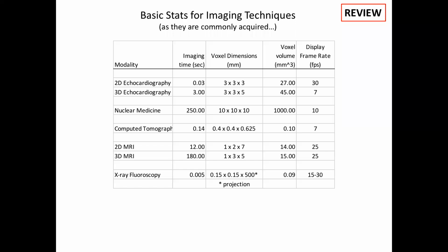Okay, so I have one single plane inside the patient, and I'm making images of that plane 30 times a second. And so it's right up at the limit of your visual acuity to look at changes in time, right? I think your eyes are probably only at 30 frames a second, somewhere around there.